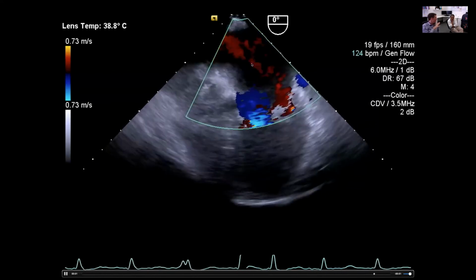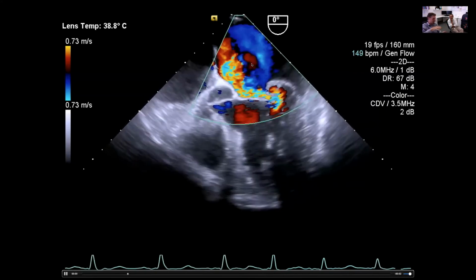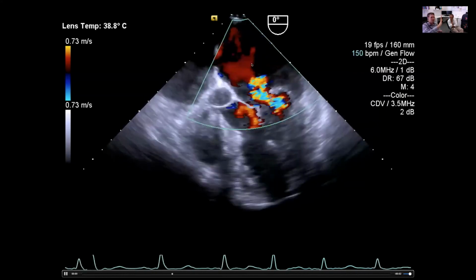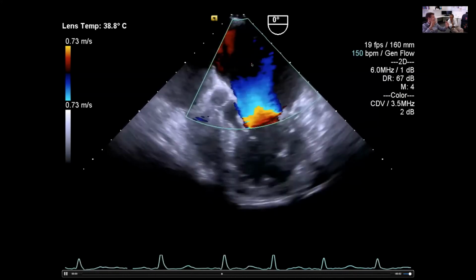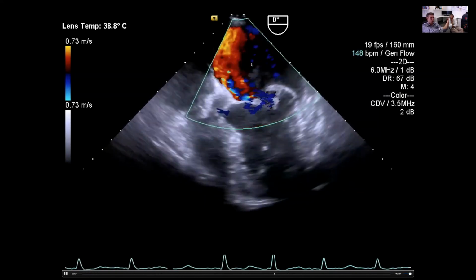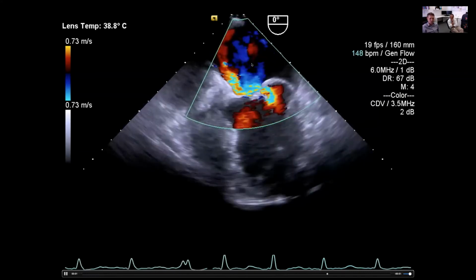No, it's the Coanda effect. Yes, because that's the one that makes planes lift off of the ground. So when we've got an eccentric looking jet, some of that kinetic energy is transferred to another kind of energy that sticks it to the wall, which means that you don't get a lot of the other chaotic motion that comes in. Okay.